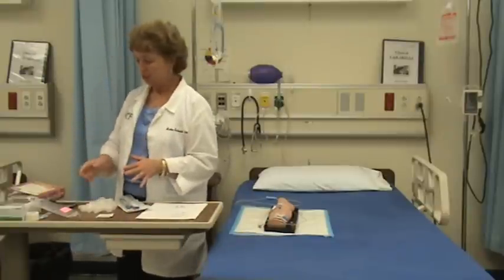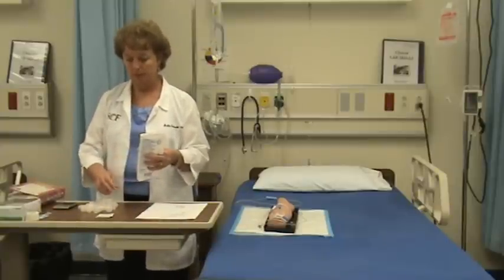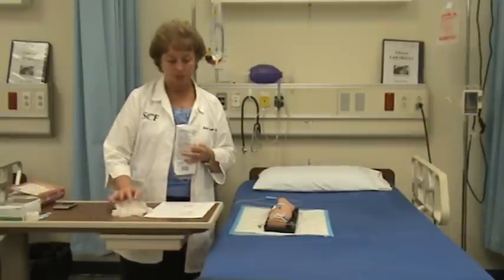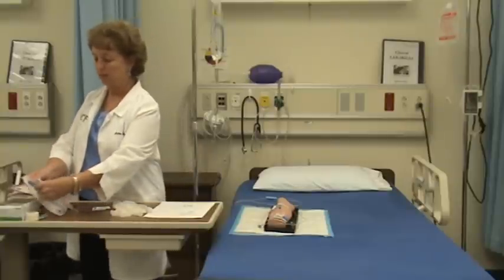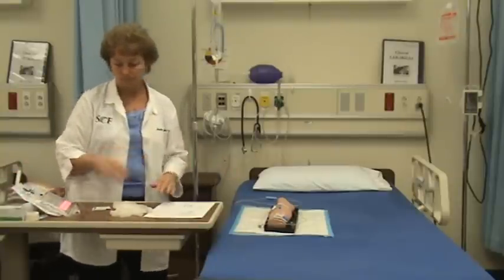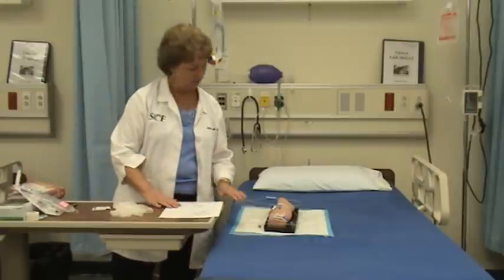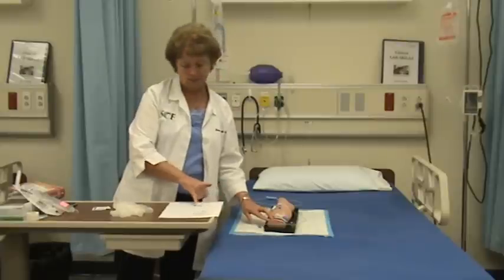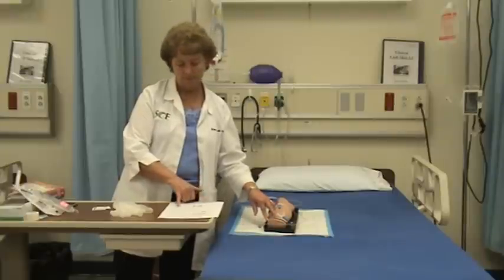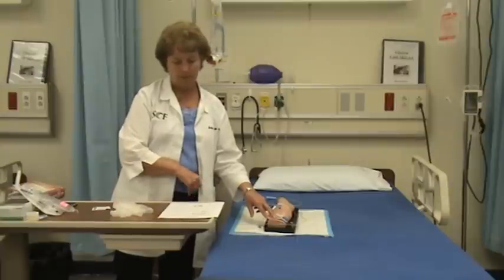Now I'm ready to go into the patient's room. I've got my IV antibiotic, secondary tubing, alcohol swabs, and my MAR. I come into the room, set my supplies down, wash my hands, identify myself to the patient, and do two identifiers with the patient and the MAR. The patient ID is 871925. I ask the patient if he has any allergies — he doesn't — and I check for allergies again on the MAR.